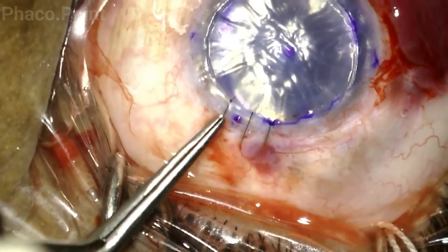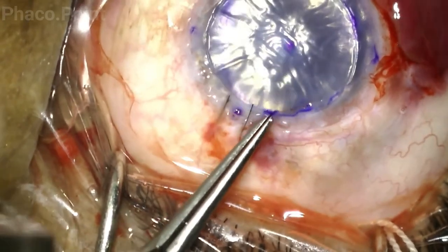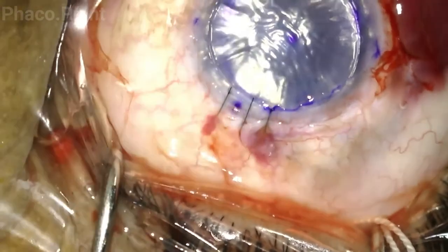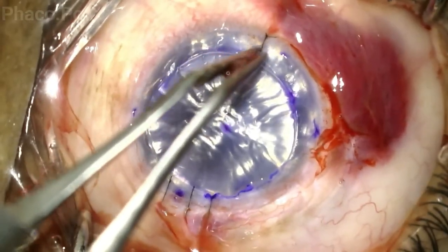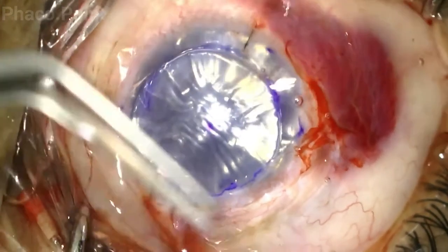The suture ends are cut short. To bury the suture, it is held firm with the forceps and turned downwards towards the cornea whilst simultaneously applying counter pressure from the inferior limbus and pulling the eye upwards. Similarly, the eye is pulled upwards and the suture held firm and pulled downwards to bury it on the scleral side.